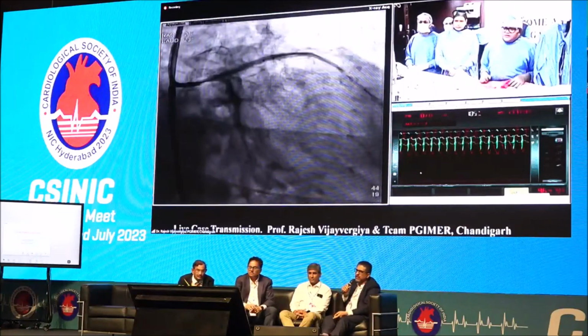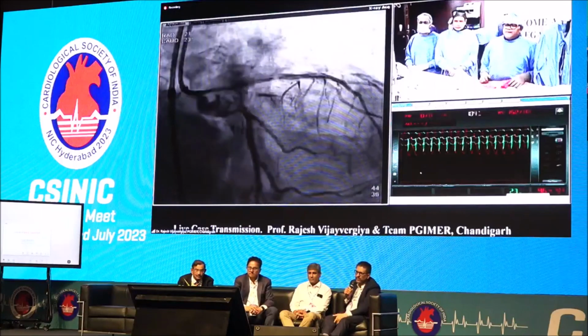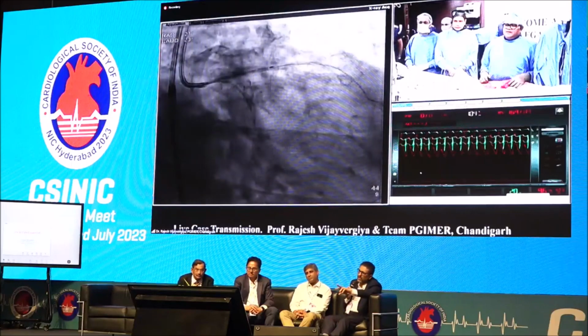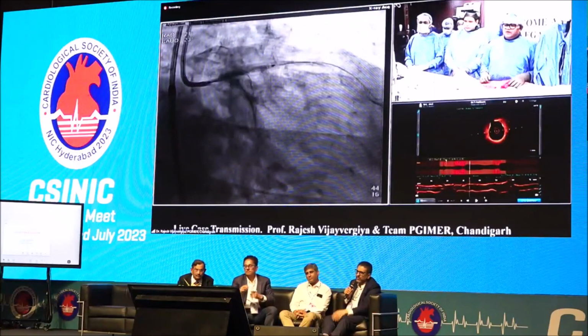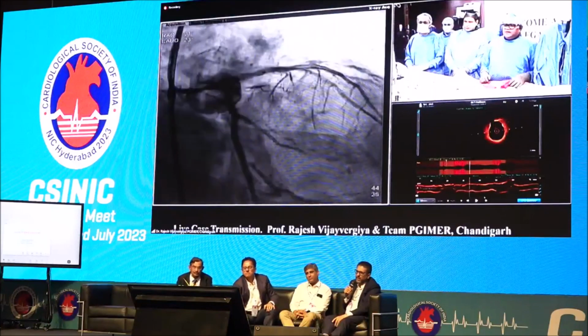Dr. Rajesh, yes, you are managing 3 wires now, and now you are putting a stent across the left main to LAD. Would you like to see that first bifurcation, and you want to remove the diagonal wire because you are trying to jail 2 wires? Because how you are managing these 3 wires is also very important.